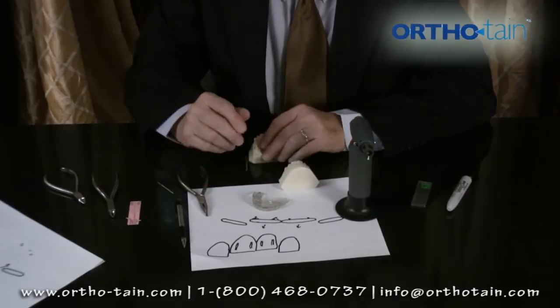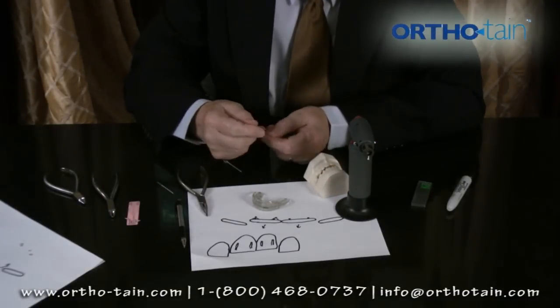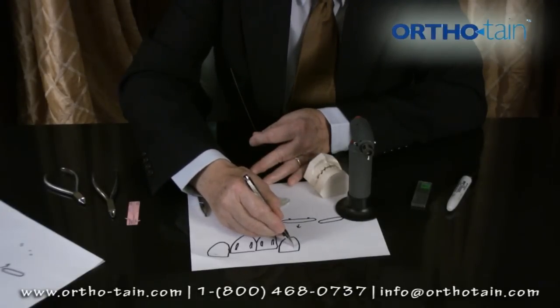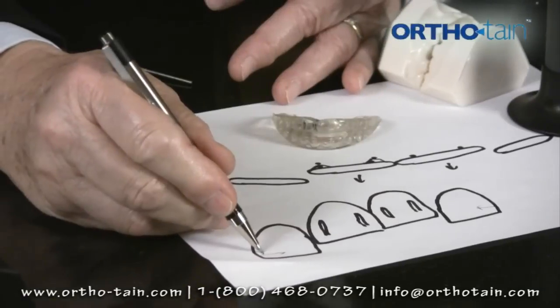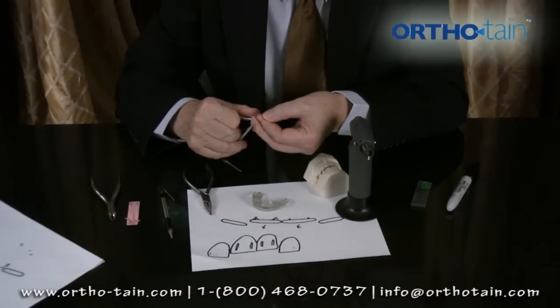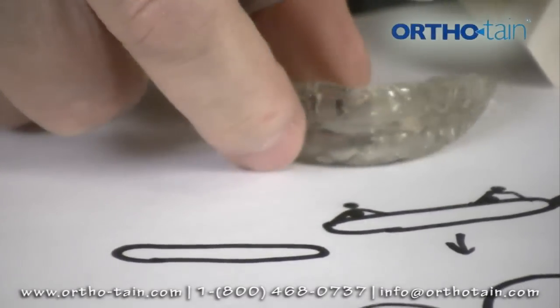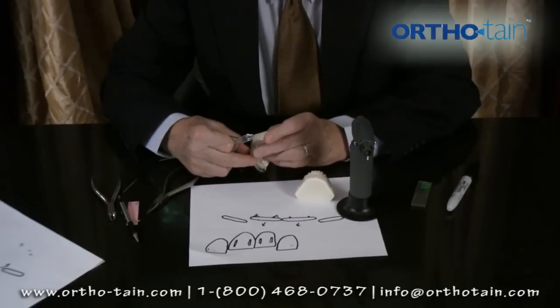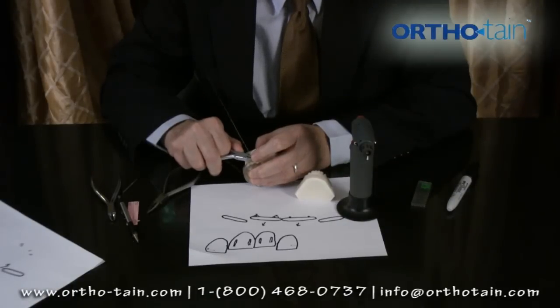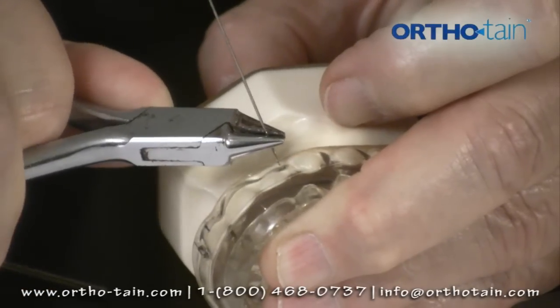Another wire we might use is called a labial-lingual wire, used to move teeth. For example, if we wanted to move this tooth to the center or close a diastema, we might want to put a wire about a millimeter short of the distal surface of this tooth. We grab this wire with what we call a 139 plier — it's an orthodontic plier, very handy. We put the appliance in the mouth, and now we want to move this tooth mesially, so we put that wire about a millimeter short of the distal surface.